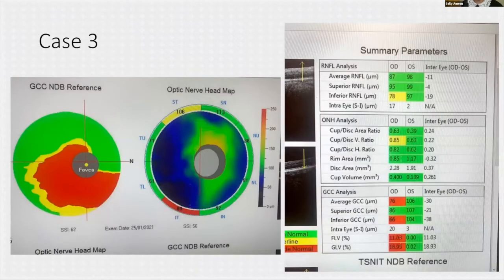So the next clinical scenario, just to make sure that I am on the same case, is probably the opposite. So this was an elderly gentleman that was referred in with essentially query glaucoma. He has a known history of pseudoexfoliation, but now is pseudophakic, never really had any high pressures with the pseudoexfoliation, and there's no family history of glaucoma that he knows of. So the optic nerve scan does show a healthy nerve fiber layer in both the eyes, with a slight disparity in the cup disc ratio, with it being high in the right in comparison to the left. And maybe with the OCT, there is loss of nerve fiber on that side, but nothing really untoward. And like I said, the pressures were normal.